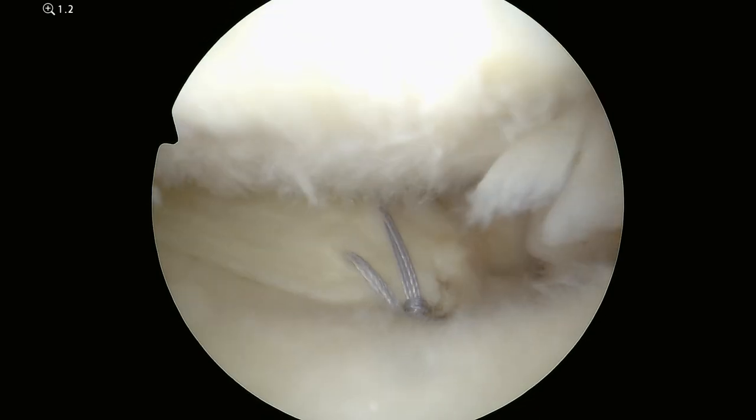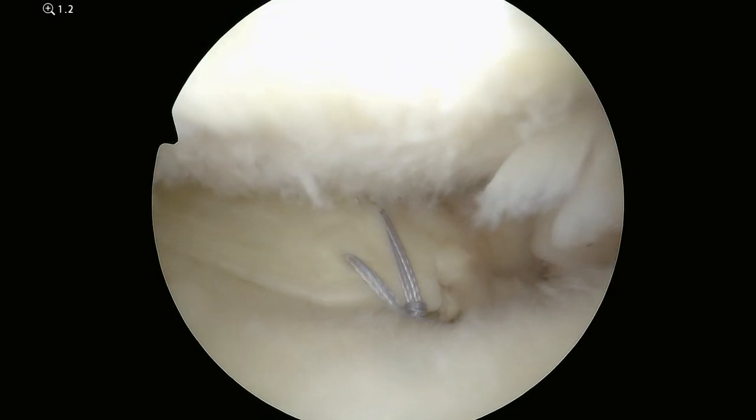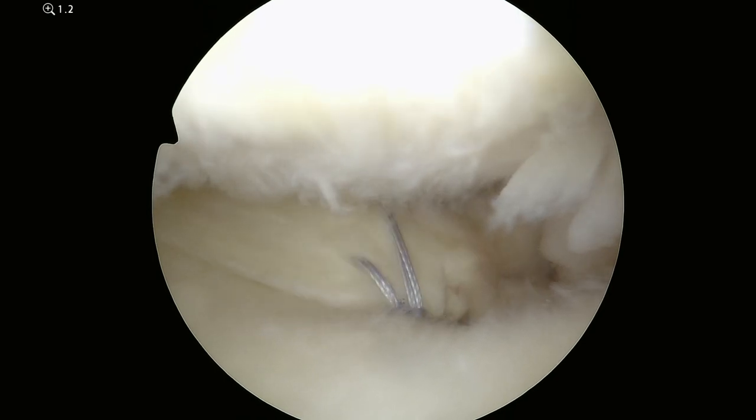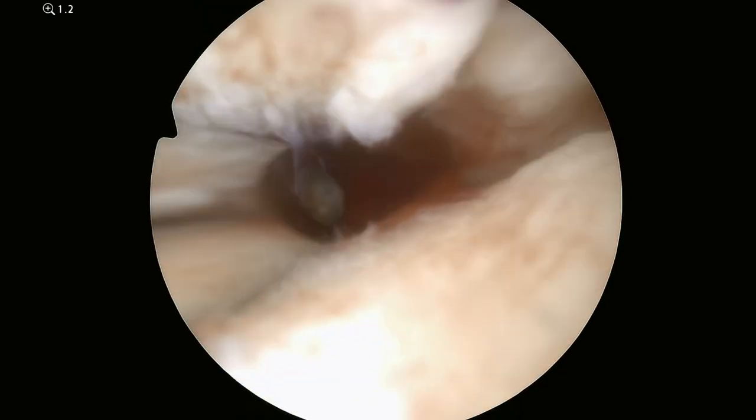Now I tie these over the metal button on the outside of the knee to secure it to the knee and to maintain that tension.